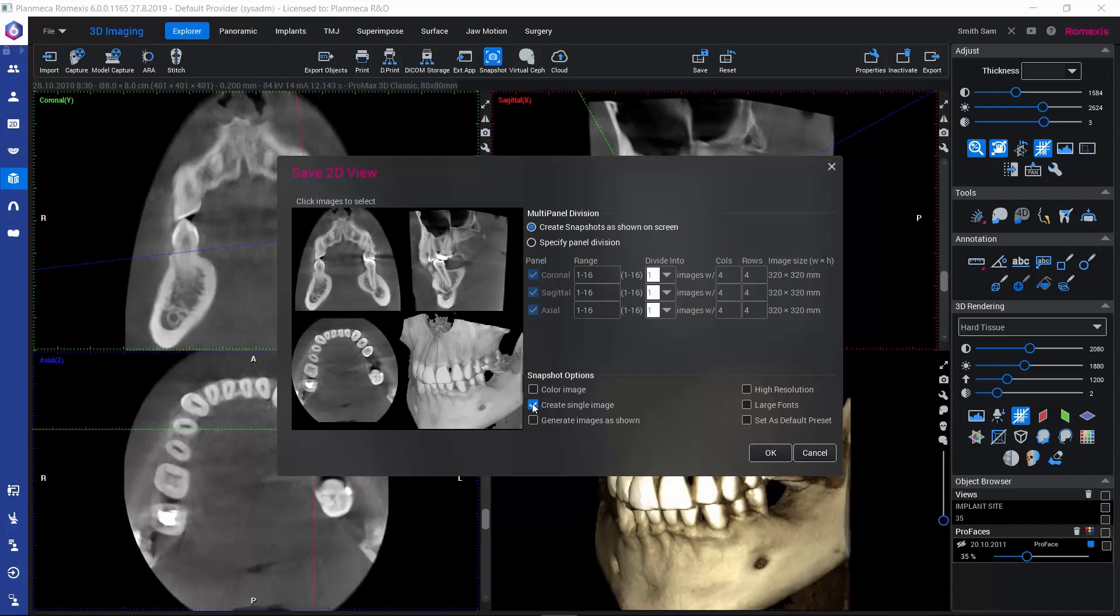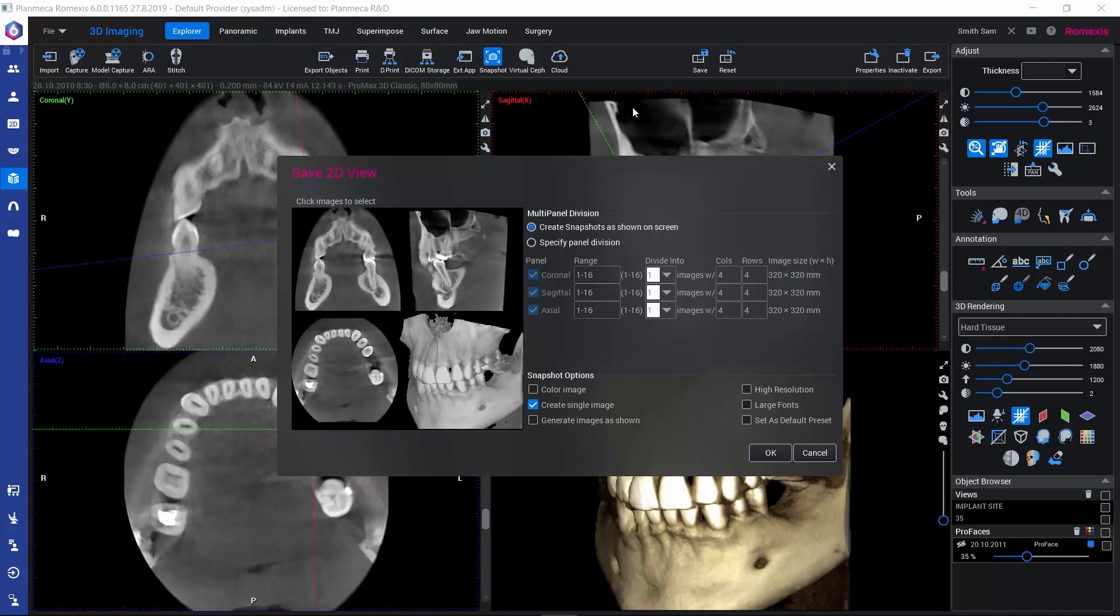If we create a single image, we will have one image containing all of these views. Instead, if we deselect this, we would get four separate images. Generate Images as Shown saves the images with the zooming level that is applied currently on the screen, and High Resolution increases the resolution.